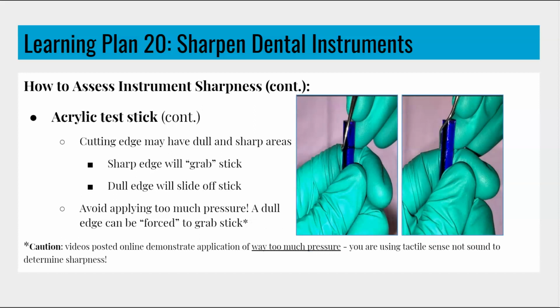Beware of online videos that demonstrate heavy pressure to produce a sound to determine sharpness. With light pressure, a sharp cutting edge grabs the stick, and a dull cutting edge slides off the stick. When heavy pressure is applied, even a dull edge can grab the acrylic stick.